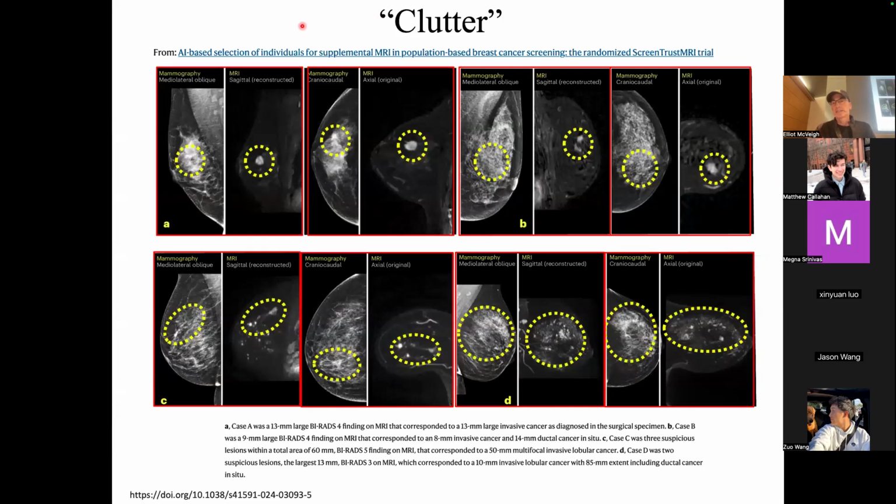The other image quality thing that we try and improve is called clutter. And here we have a mammogram. This is an X-ray mammogram, and you can see there's a dense piece of tissue in there that is giving us this signal. When we image that with MRI and a contrast injection, then just this little core lights up. So we got rid of all of this clutter. It's not that the signal to noise is bad, it's just that there's so much stuff going on that you can't see what you're looking for.